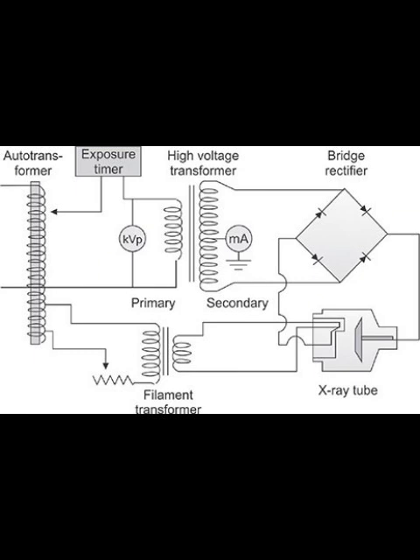Okay, so we've got this chaotic AC coming in from the wall, but the delicate X-ray tube demands this perfectly behaved one-way DC flow. How do we bridge that gap? How do we convert that wild AC into the gentle directional current the tube needs? That's where the rectifier comes in. And it's really quite ingenious.